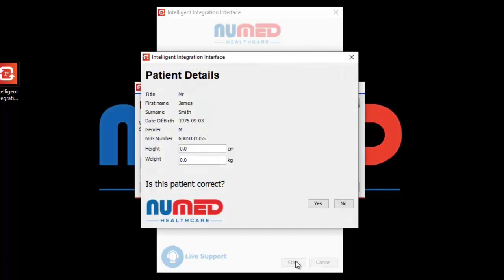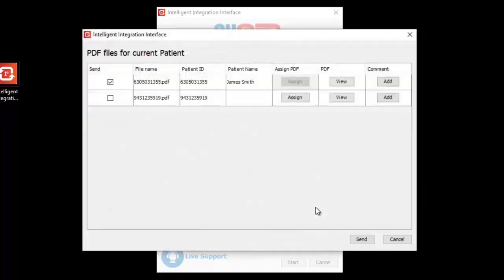I3 will now connect to System 1 and retrieve the active patient's details. Confirm these details are correct by clicking Yes. These details will then be used to identify ECGs intended for the confirmed patient. A list of ECGs stored on the memory card will be displayed. The software looks at the patient ID of ECGs stored on the card and attempts to match them with the currently selected patient in System 1.